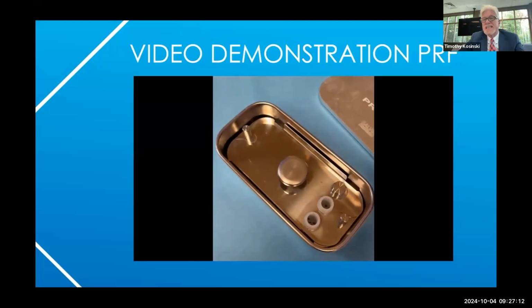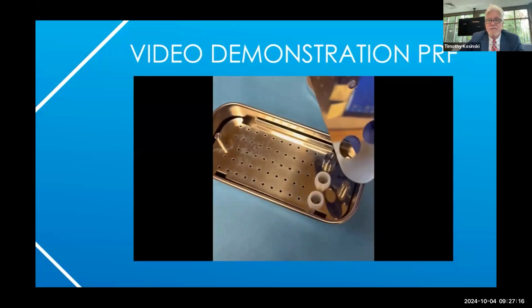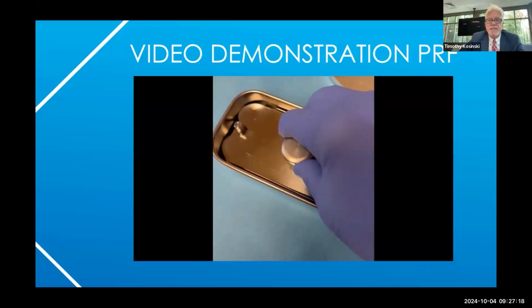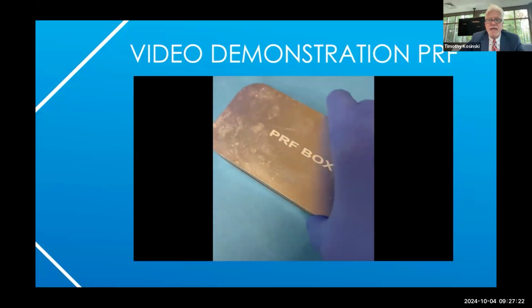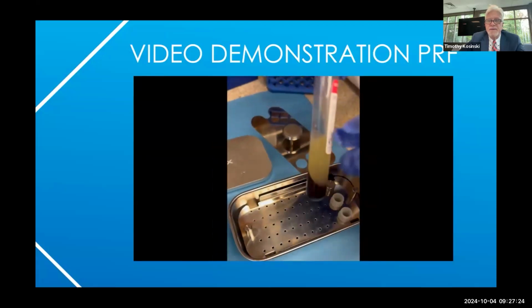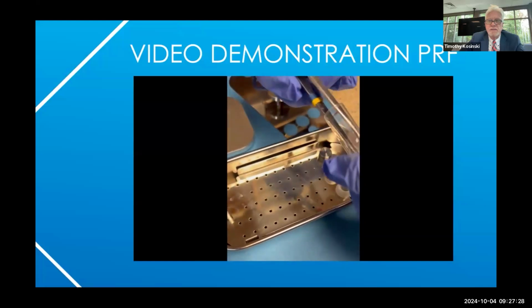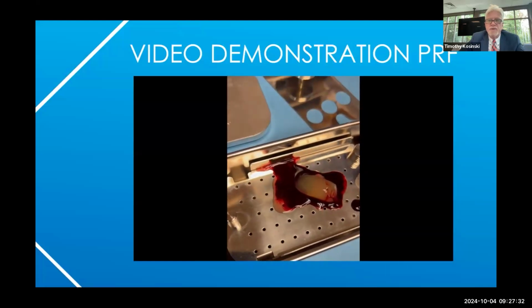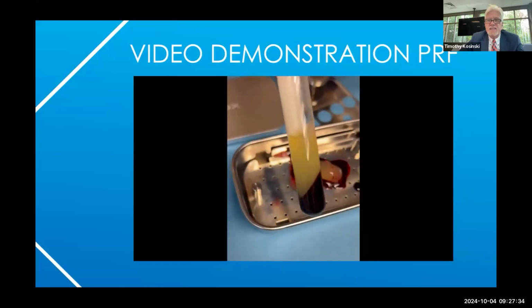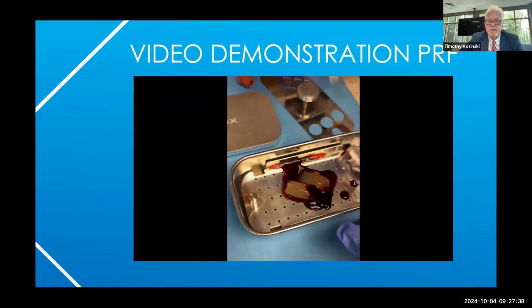We can make what's called sticky bone, or we can use it as a membrane itself. Here we'll compress the clot that is formulated through spinning. And again, this has all the bone morphogenic proteins that stimulate bone and tissue health.